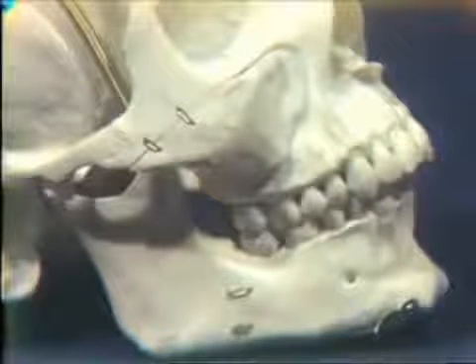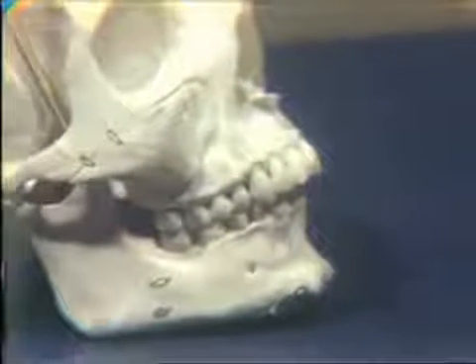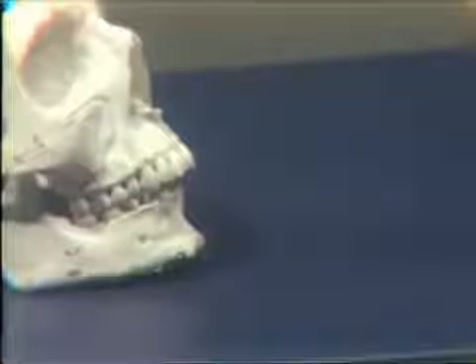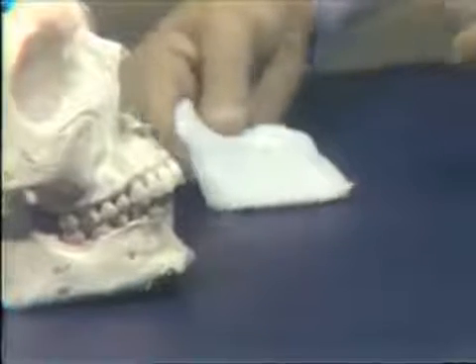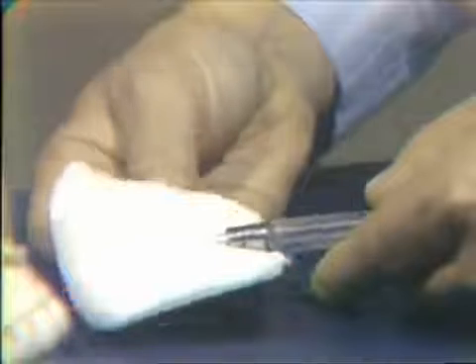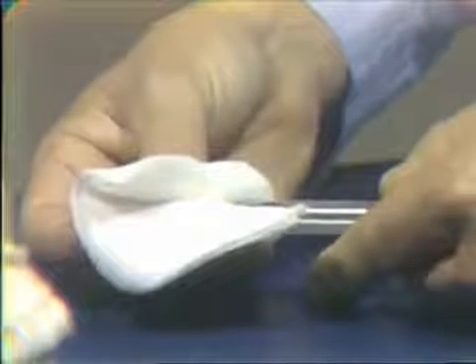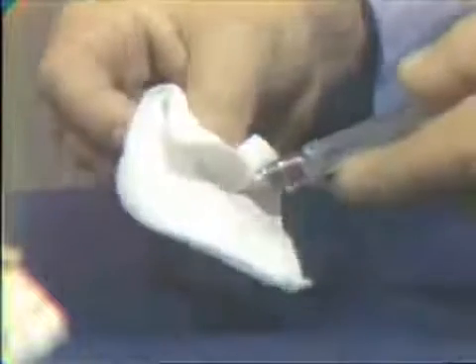I'd like to show you briefly how we curve the needle with a sterile gauze to keep the needle sterile so that we can keep close to bone as we approach the posterior superior alveolar foramina. You see I have a gauze square here in my hand, and we just lay the syringe and needle on it, and then I fold the gauze over it so that I'm engaging it with finger and thumb, and still at the same time keeping the needle sterile, and I just give it a little twist here.